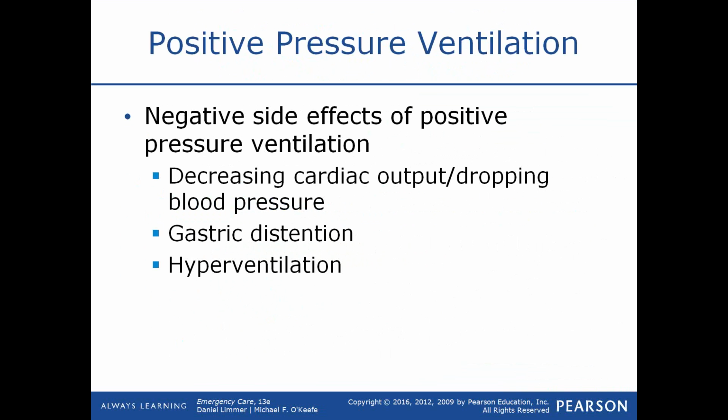The negative side effects of positive pressure ventilation is that if I ventilate them too fast, I can fill their chest up with air and trap that air inside their chest because I never give them time to adequately exhale if I'm constantly squeezing the bag. That will cause a drop in cardiac output and a drop in blood pressure.